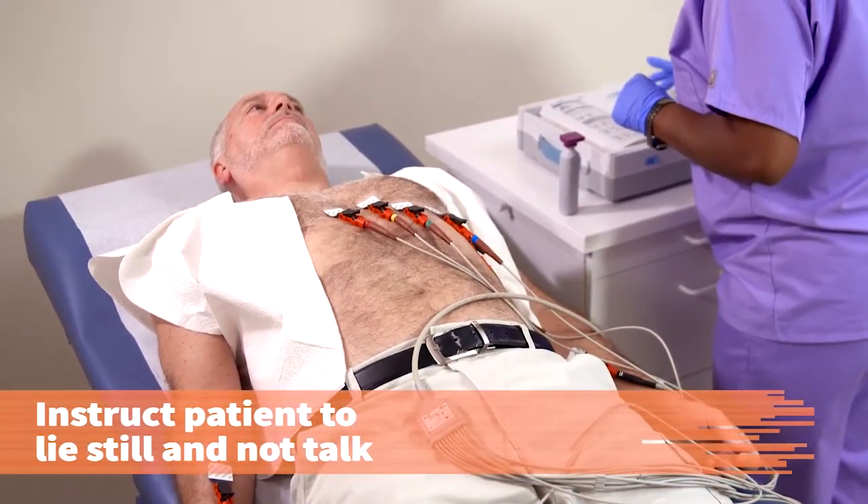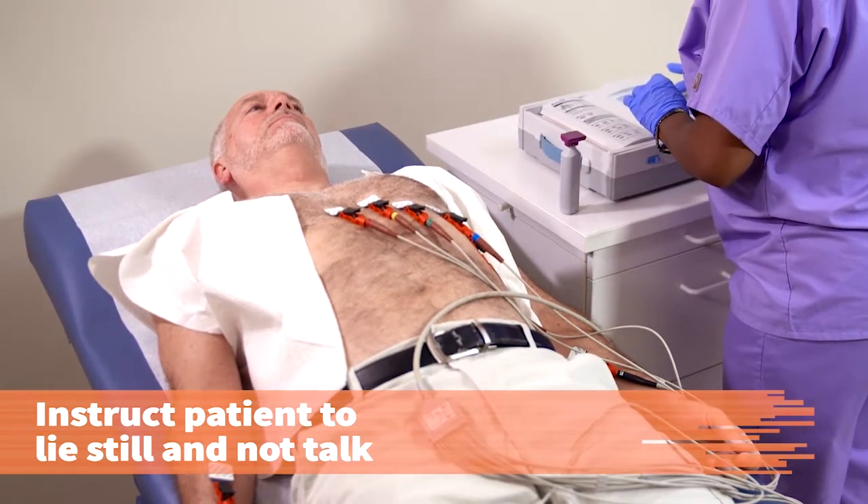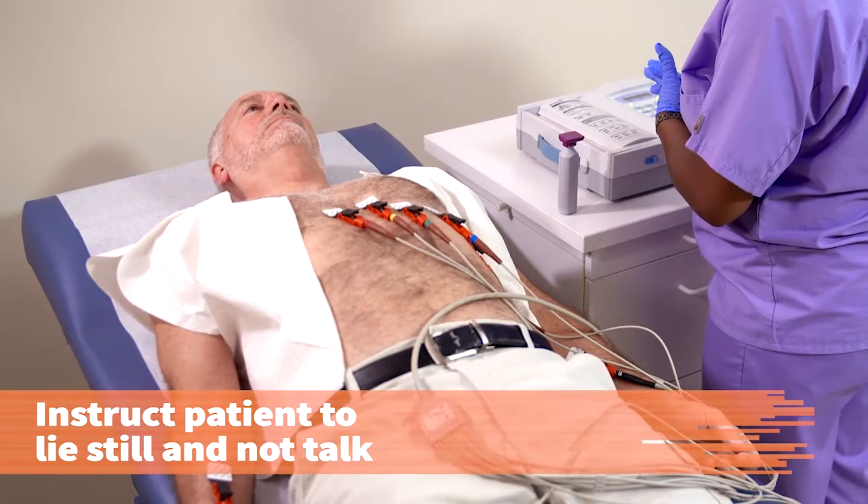Instruct the patient to lie still and not to talk during the tracing. Alright, Rick, I need you to lie there and try not to talk or move — just relax, okay?